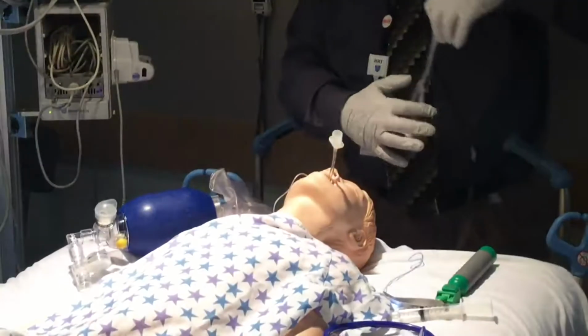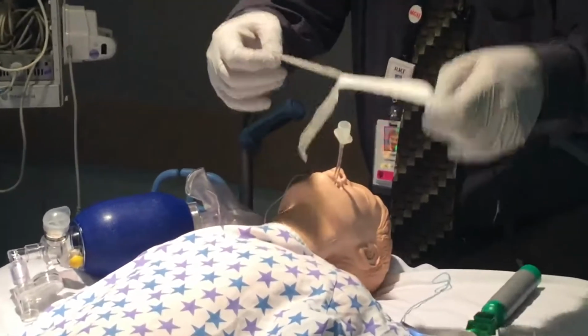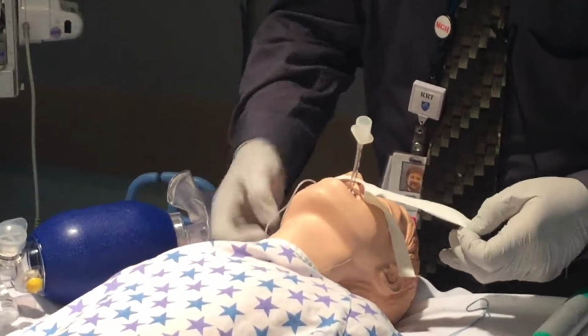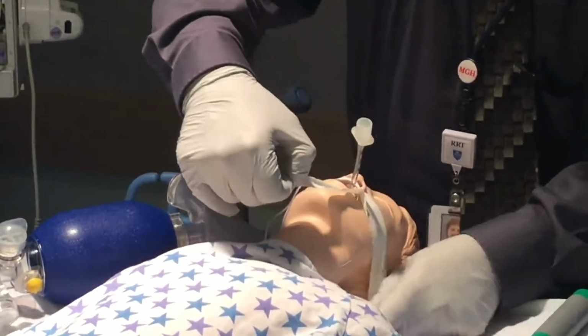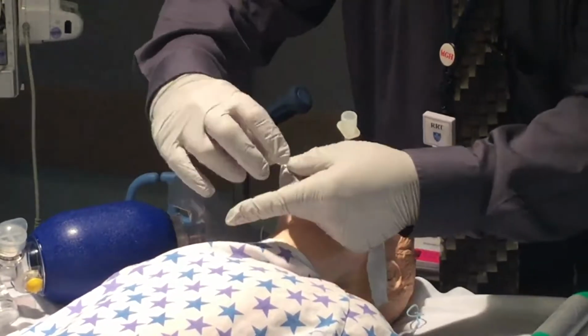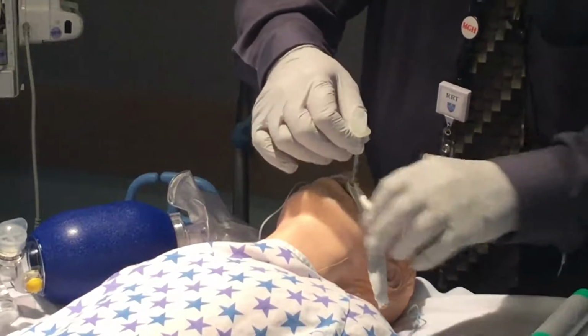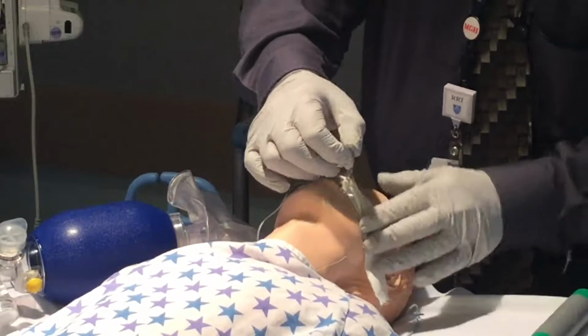Once the tube's inserted and placement has been confirmed, the tube must be secured. Some people use tape. You can use commercially prepared devices if available. In this case, I've split a piece of tape. I'll secure it to the patient, then wrap the other piece around the tube so that it's secure.